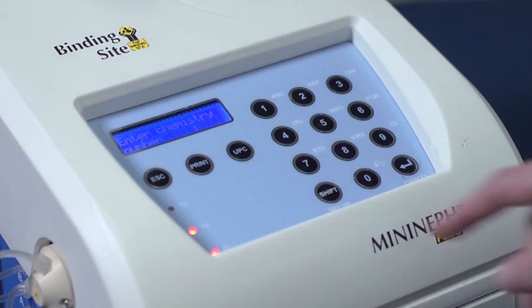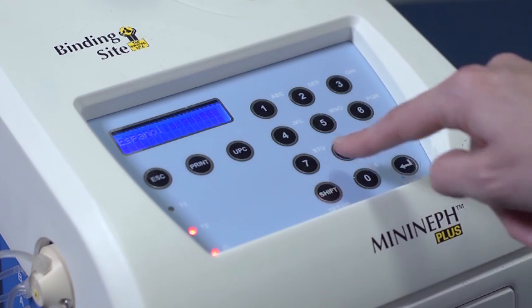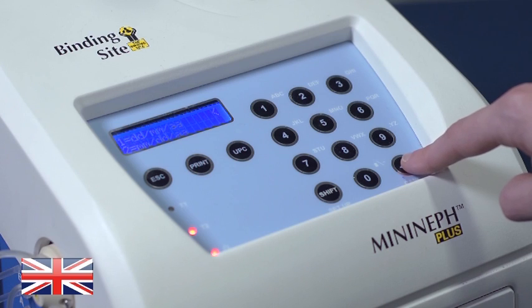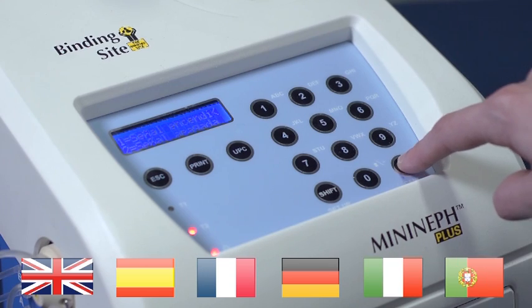The analyzer is very user-friendly, with simple-to-follow, step-by-step instructions displayed on a bright, backlit screen. There are six language options available – English, Spanish, French, German, Italian and Portuguese.